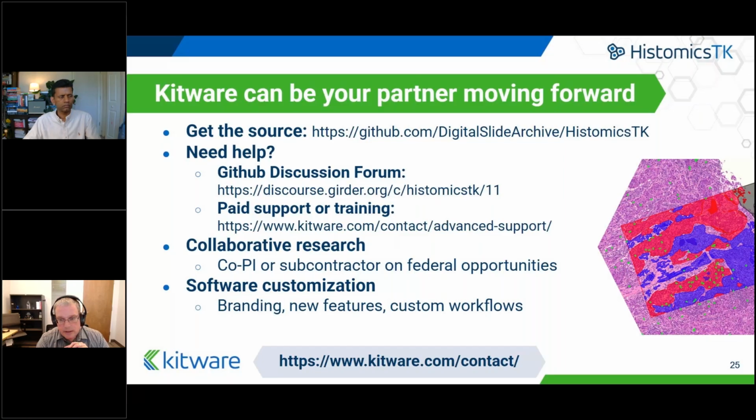If you want to customize the software to meet your custom workflow, or you say, I've got an algorithm and I don't know quite how to do this, you can figure it out. We have documentation that should let you do that. But if you don't want to spend the time figuring it out, it can be a much more effective use of your time to do what you're good at and let us do what we're good at, rather than have someone do something they're not an expert at. Just as I want a pathologist to tell me what my kidney is, I also want a software person to work with your software. And so that's where we're at.